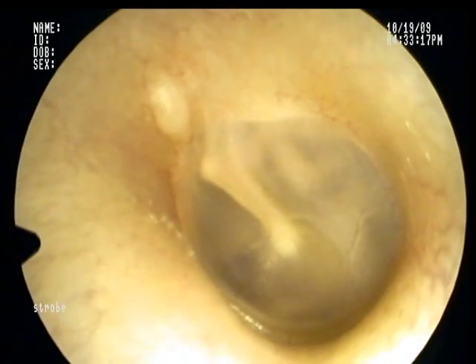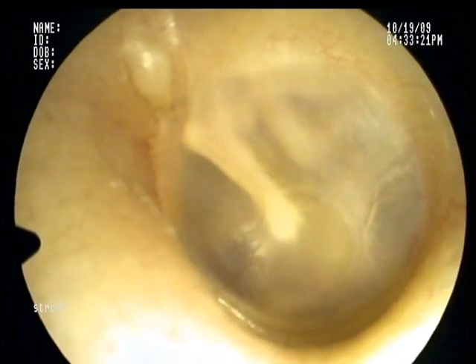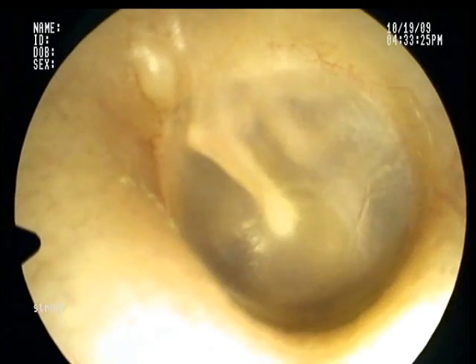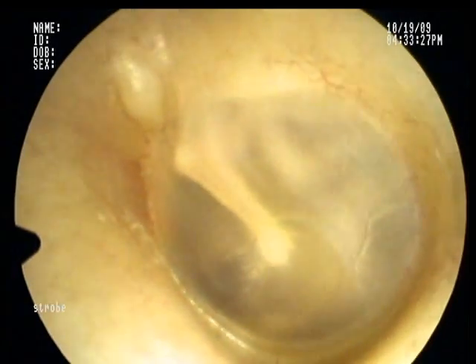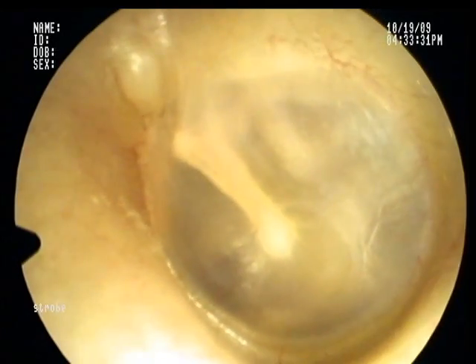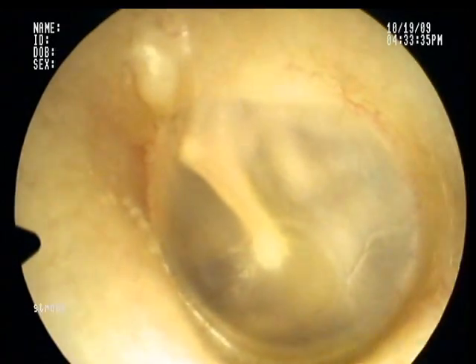This is Dr. Ryan Kaufman. This is my left eardrum, or left tympanic membrane. You can see the bone running right down the middle called the malleus. You can also see the incus bone and the stapes hiding right behind the eardrum itself, right in that upper right-hand portion of your screen.